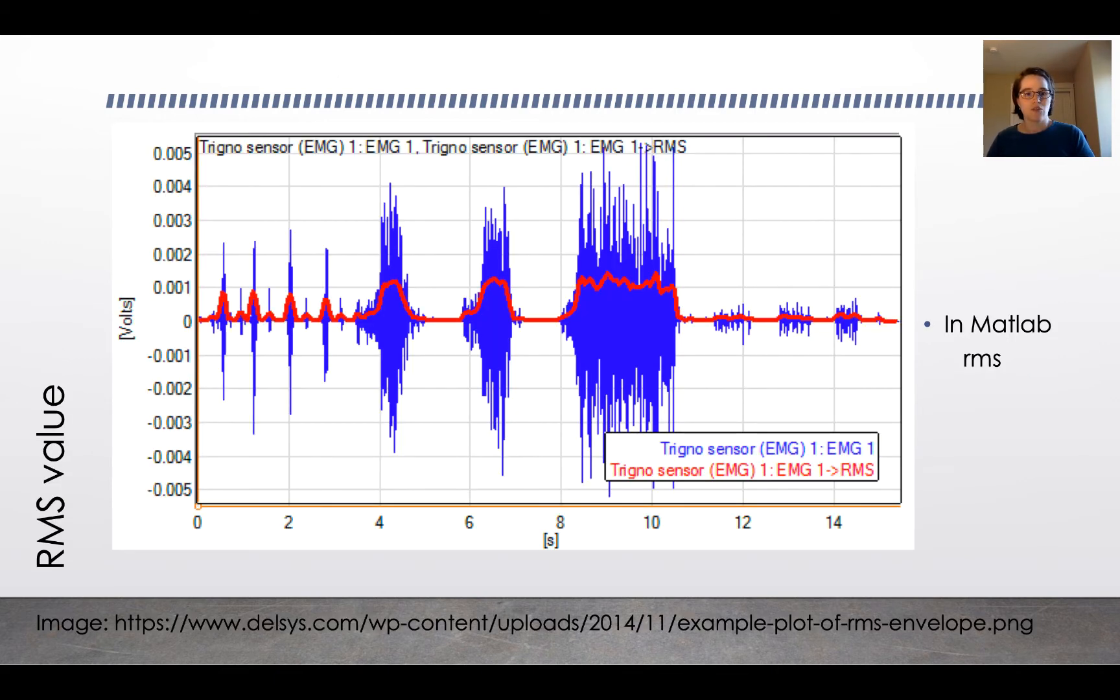Another technique that gets used when considering EMG data is to analyze the RMS value. In MATLAB there's a command called RMS. RMS stands for the root mean square value, and this is a little bit of an alternative to rectifying the signal because squaring the signal will effectively rectify the signal. You can look at how to do that with the root mean square.